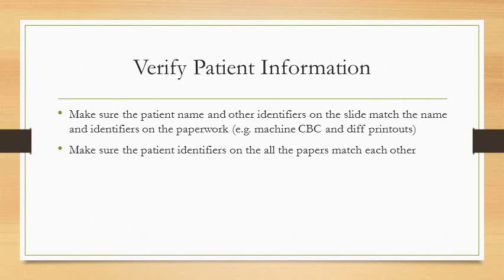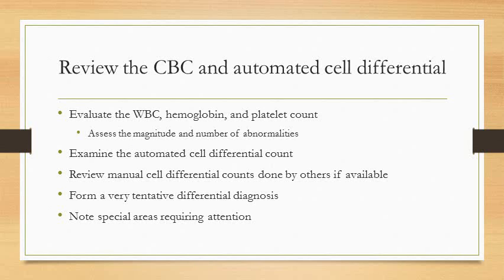You don't want to be presenting wrong data on the wrong patient, or sometimes you can get further down the list and suddenly realize you're looking at the wrong slide and you've just wasted a bunch of time. So yeah, both of those scenarios are not good. So always verify patient information on the slide, make sure it matches the paperwork.